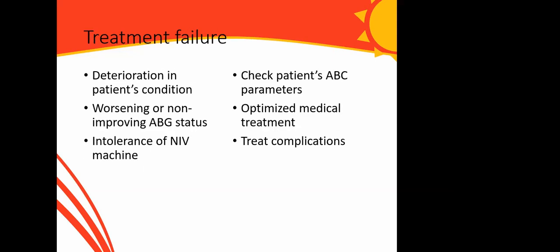Now, there are times when you felt this patient will benefit from non-invasive ventilation, but there are certain parameters that would indicate that your treatment has failed. Number one, if you observe any deterioration in the patient's condition, for instance, the patient who was awake begins to deteriorate in mental state in terms of level of consciousness, it shows that your non-invasive ventilation has failed or is not improving the patient's clinical status.